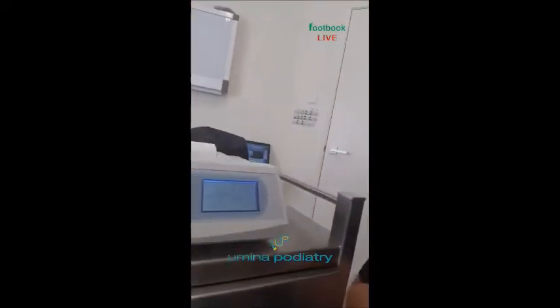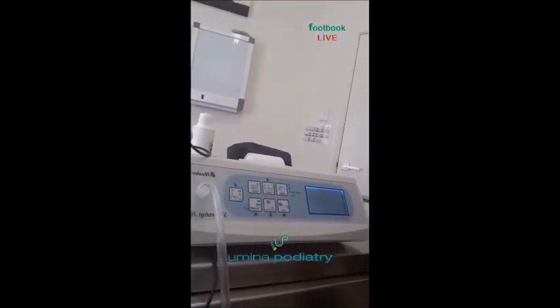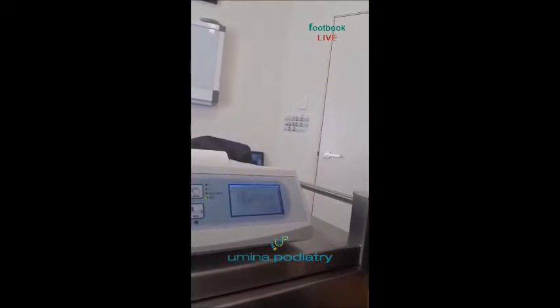I'll show you the screen here if you can see it. 251 — I think I'd better go to the doctor! We might have to try that again because that seems very high.